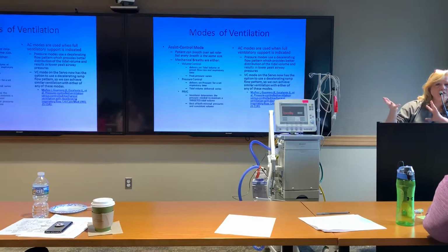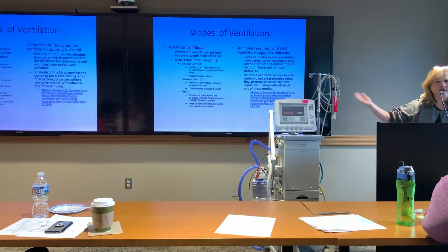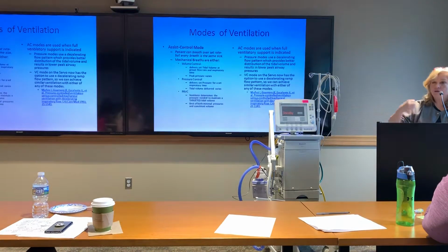I'm targeting that volume, and I'm adjusting the pressure up and down to maintain that volume. The main thing is I have a set rate and something else that designs the mechanical breath. If the patient wants to breathe again, he gets that mechanical breath. There's no spontaneous breathing. There's no pressure support in between the breaths. Every breath that he initiates will be the same mechanical breath that he gets. Same volume size, the same pressure level, same tidal volume, same whatever.